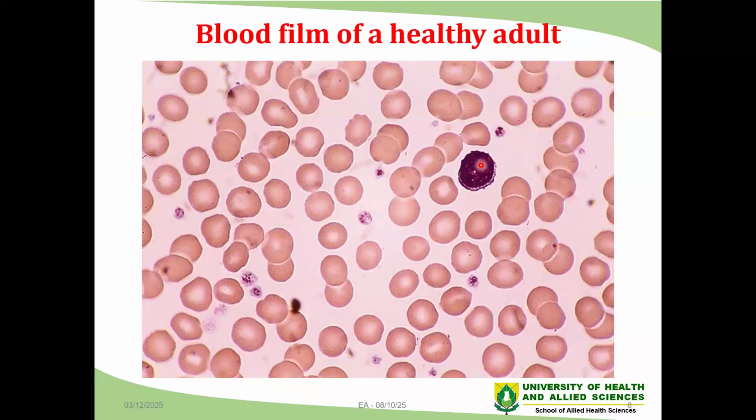And let's also note one thing, that there would not always be an agreement between what the full blood count tells you and what you actually see from a blood film. The full blood count is just to guide us when we need to do some of these morphological descriptions of red cells. However, the film will tell you what is really true.